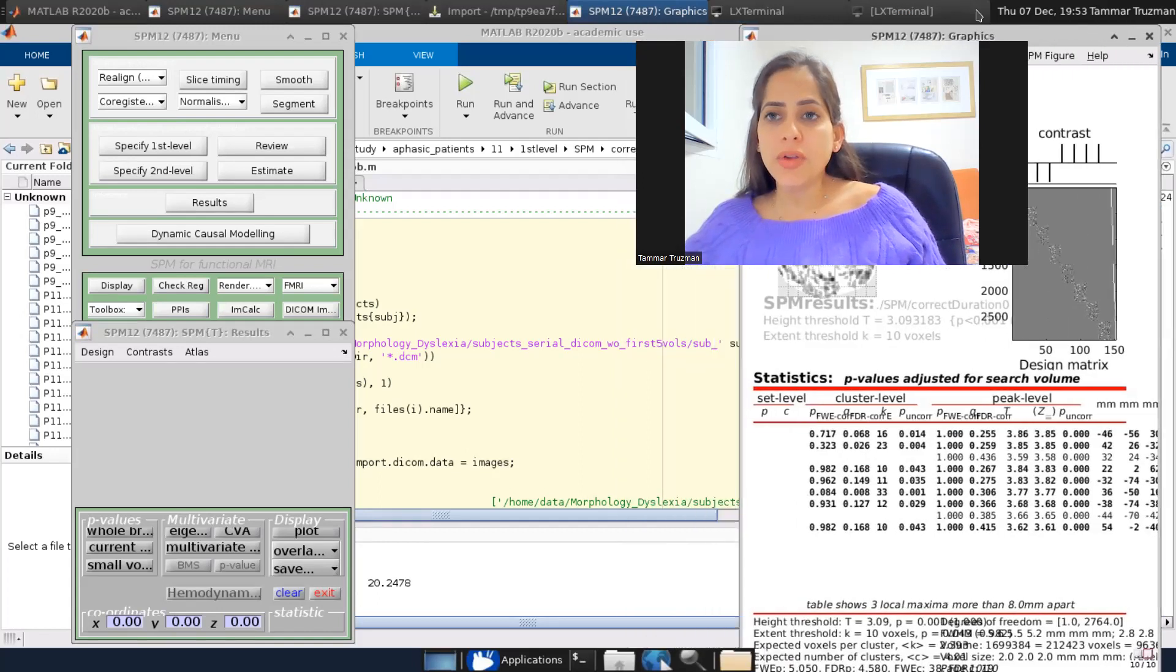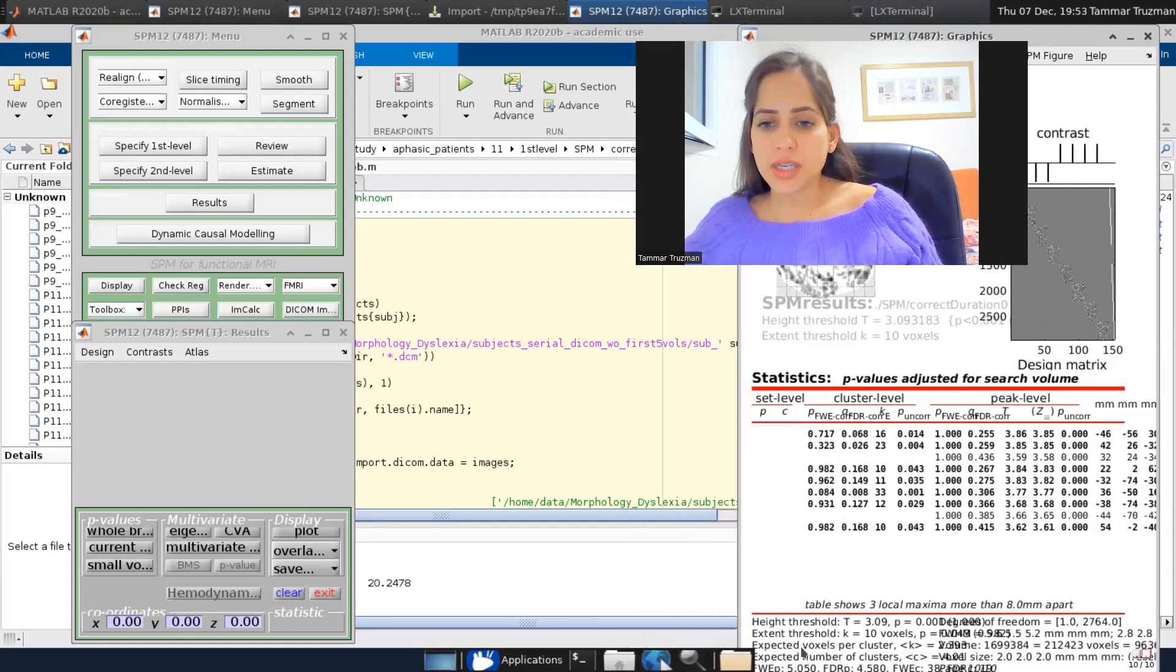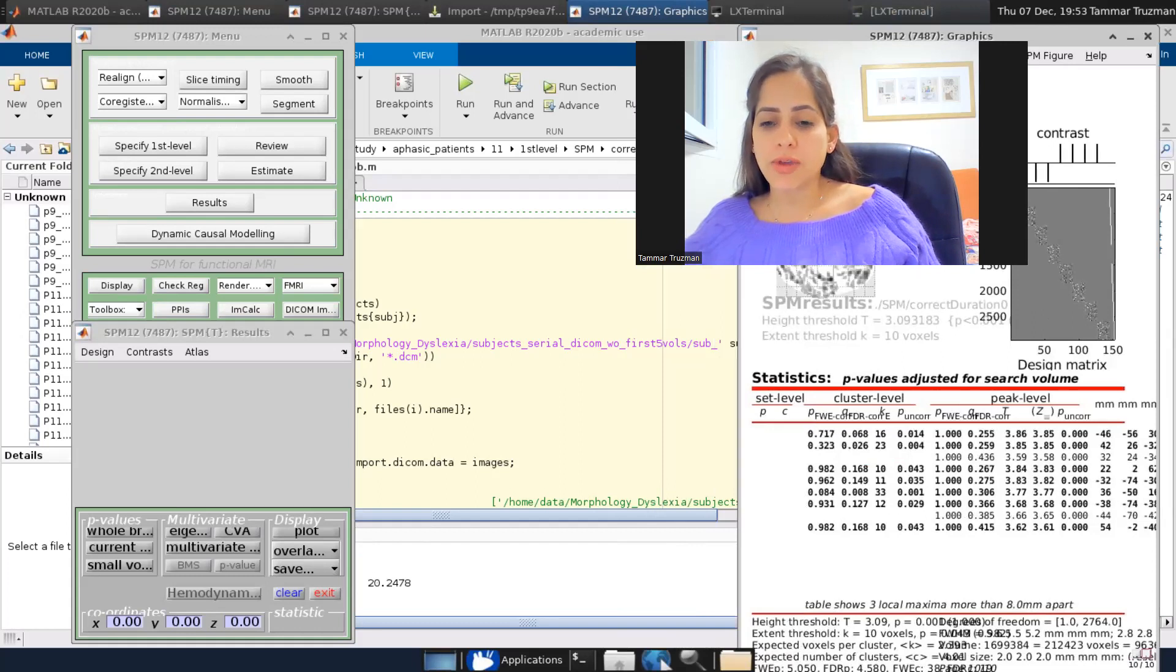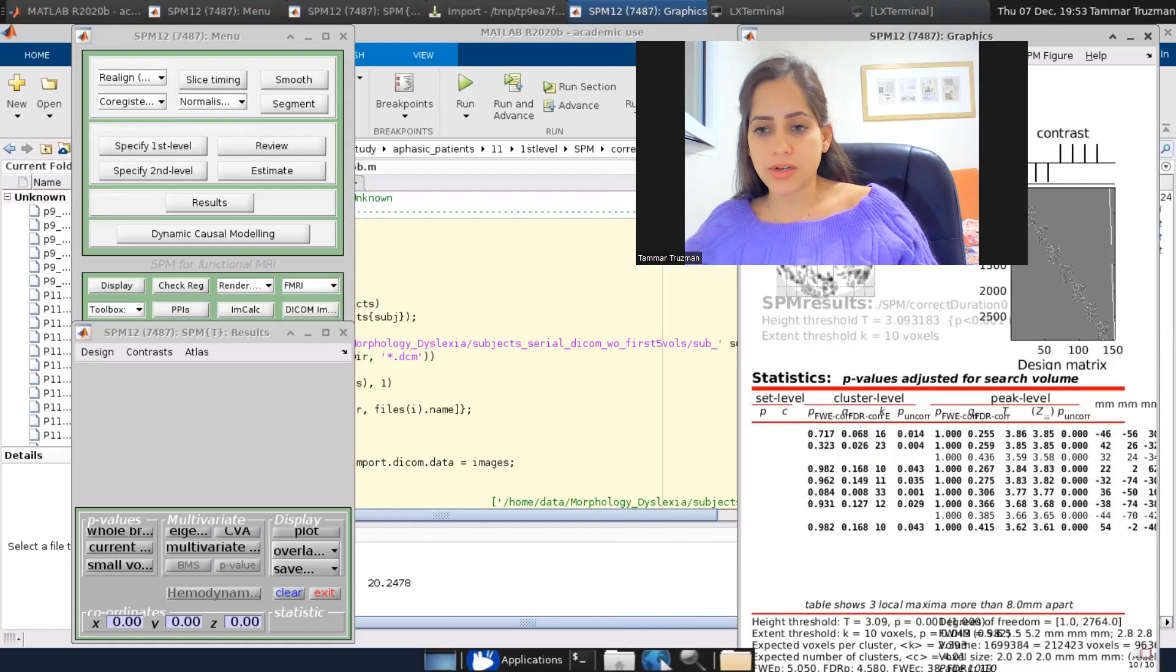Now, if you look at the bottom of the table, you can see the values of family-wise error and FDR at the peak level, as well as the cluster level C and P.